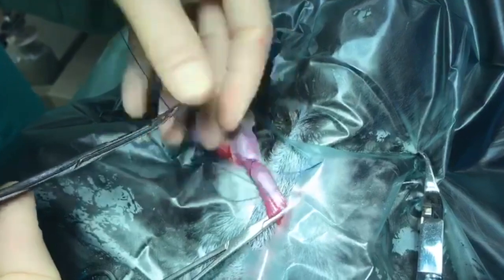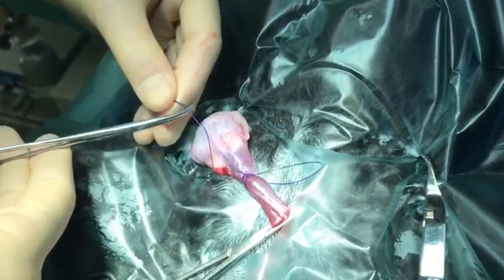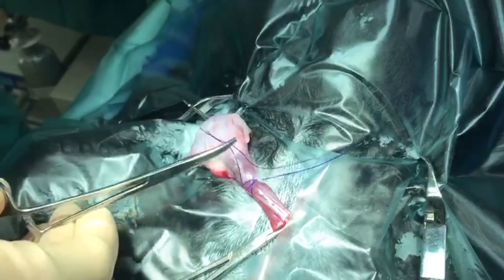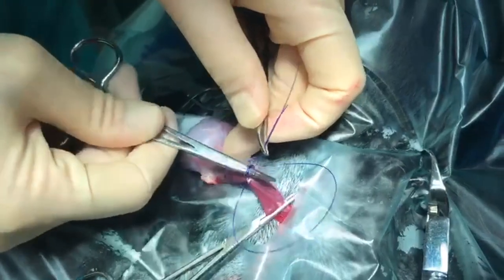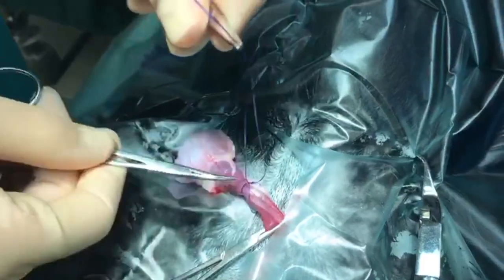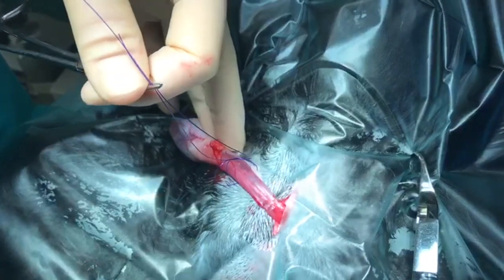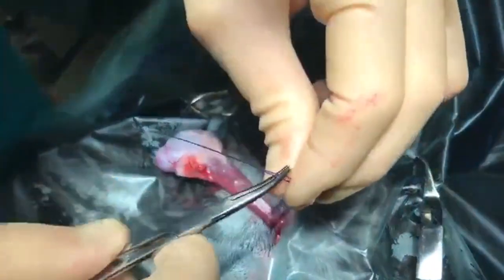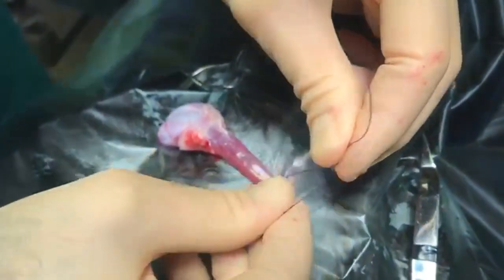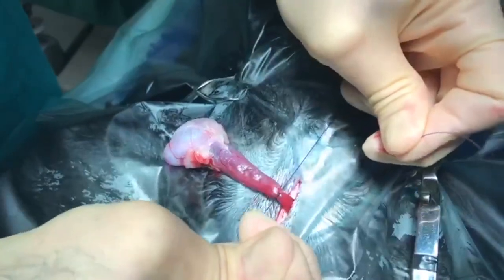I'm going to lock the free ends of the suture with a pair of mosquito forceps and then release some of the tension in the loops before I slide it into position over the pre-crushed area. Apply it into position, feel it lock, and apply a few locking throws.